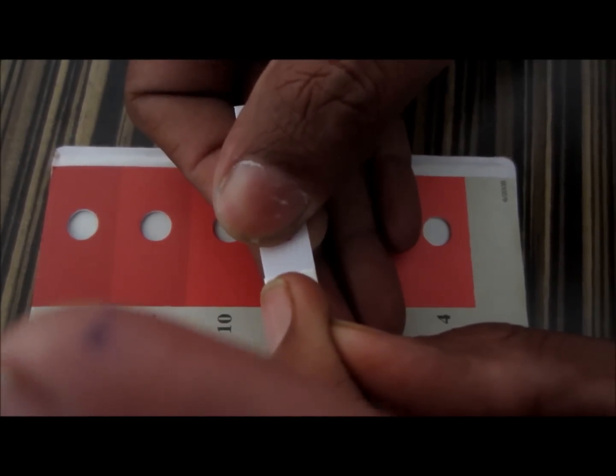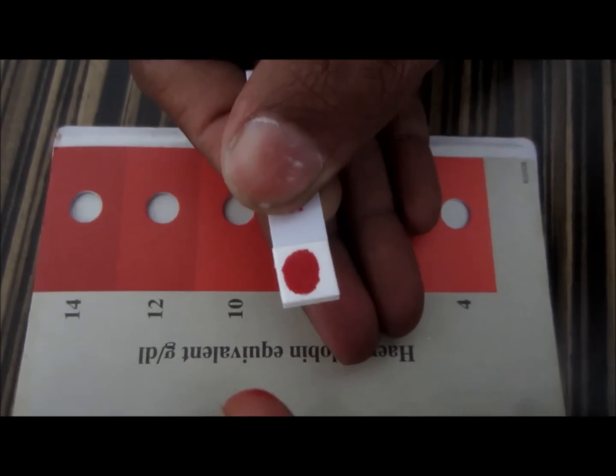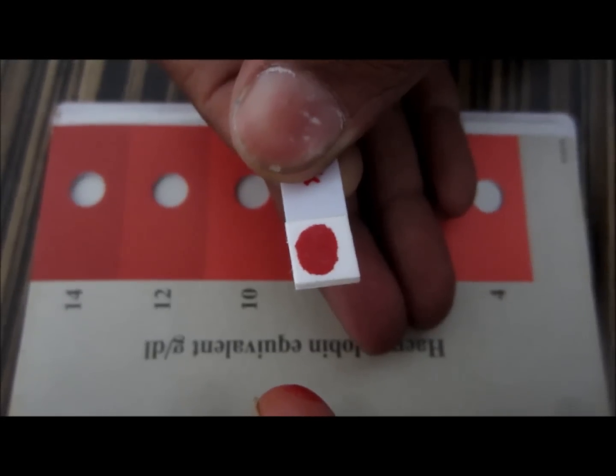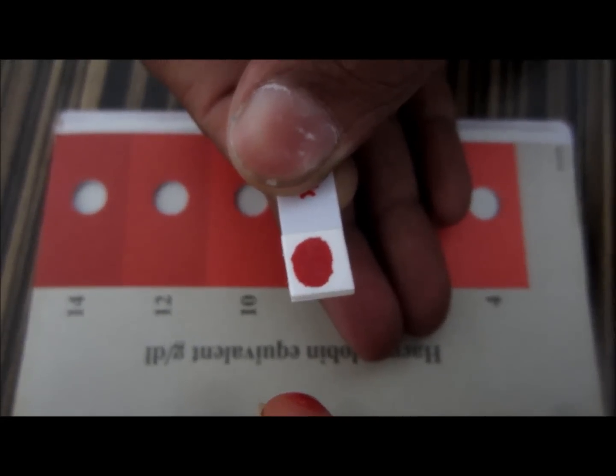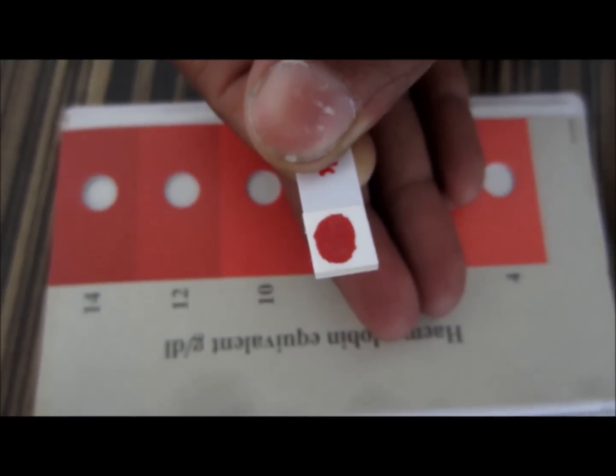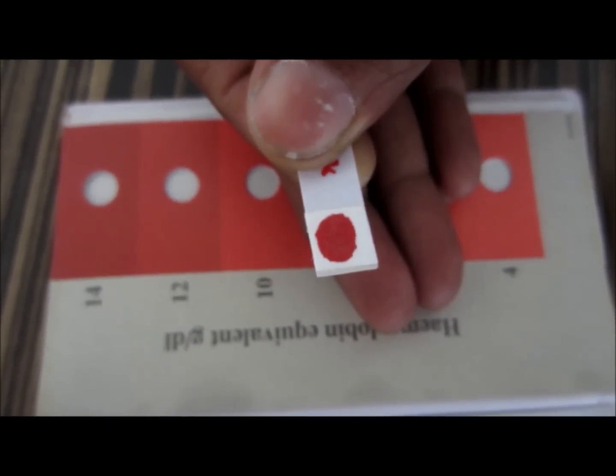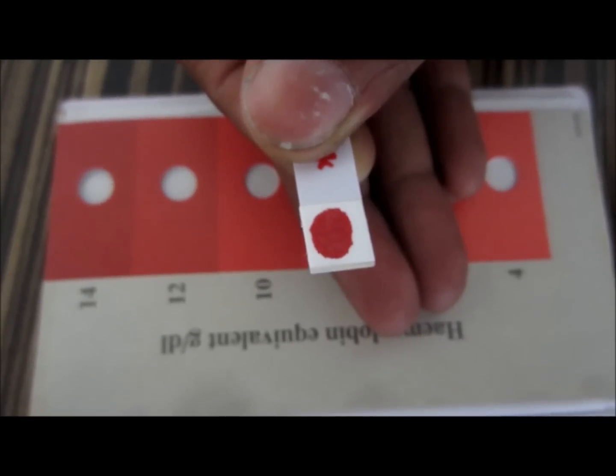You now put the drop and then you wait for 30 seconds: one, two, three, four, five, six, seven, eight, nine, ten, eleven, twelve, thirteen, fourteen, fifteen, and so on. You need to wait for 30 seconds.